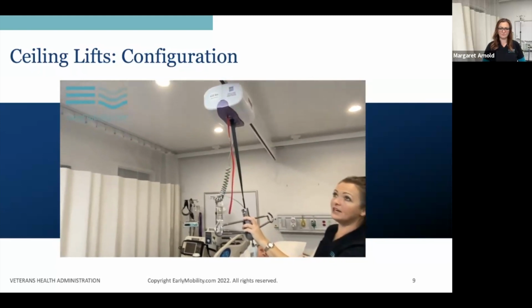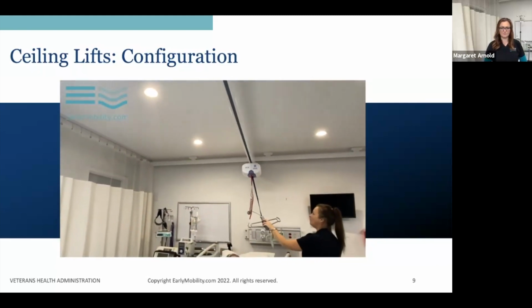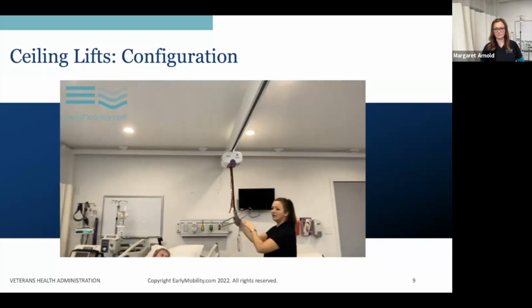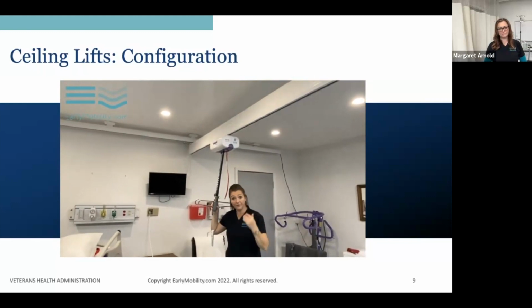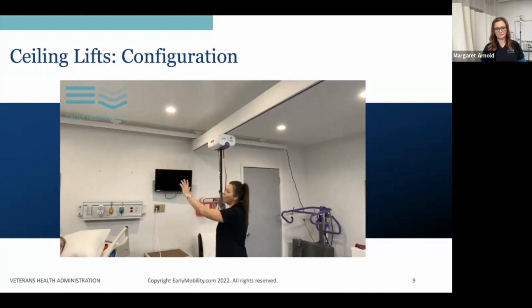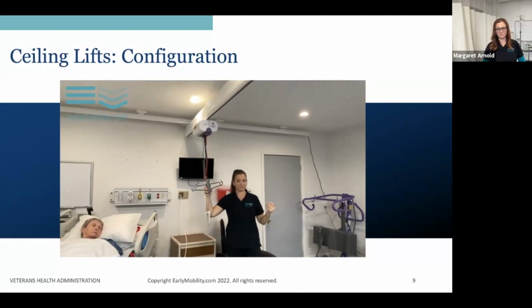The motor on the Y rail can move anywhere along the rail. So this configuration effectively gives us full coverage of the whole area under the XY system.